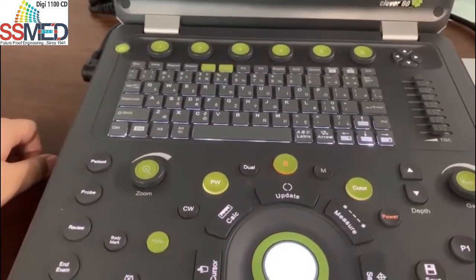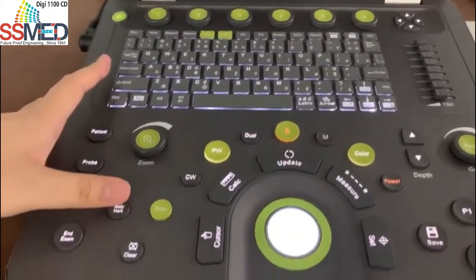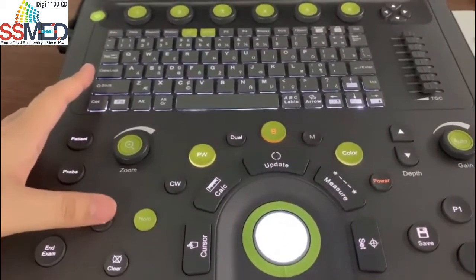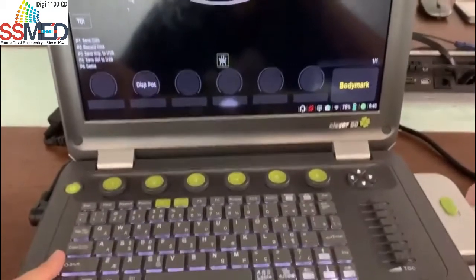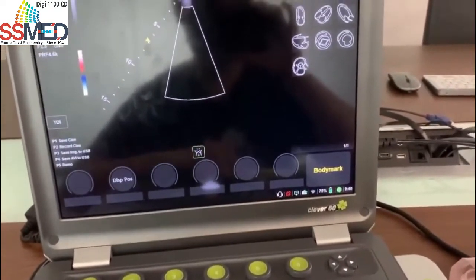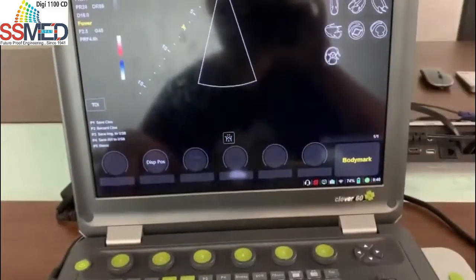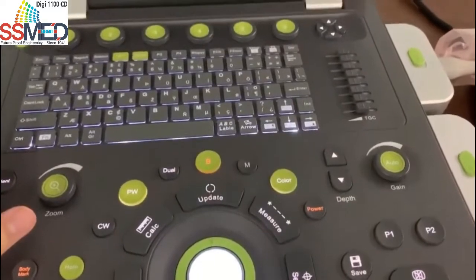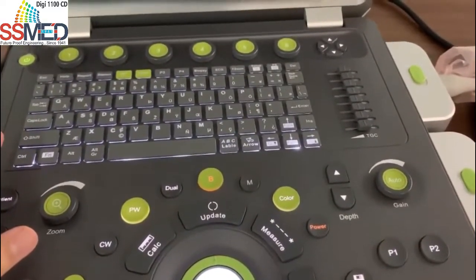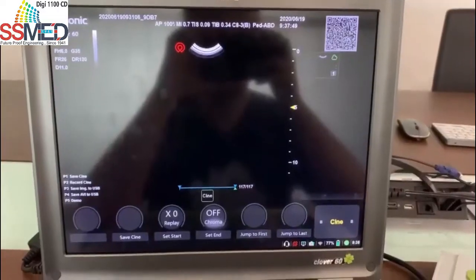We also have the body mark. And here is the body mark for cardiology. It has also been preset. You only need to change the patient package. So it will automatically be the cardiology body mark. And, of course, you can put it on your screen or clean it.